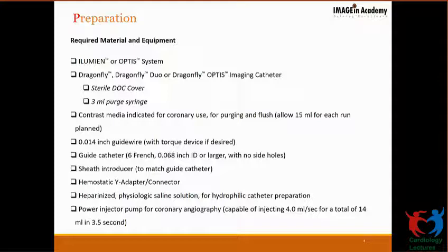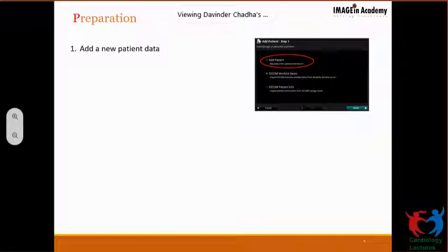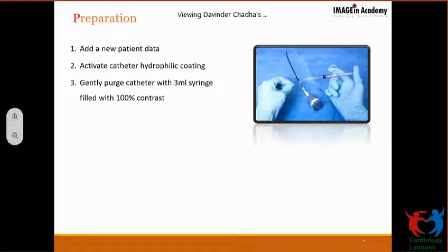Kind of doing justice to the patient, because all the desired information will be available to you. So how does one prepare? You go on to the machine and you have to add the patient data first, and there will be an interface available where you can put in the name of the patient and the vessel which you are going to image.